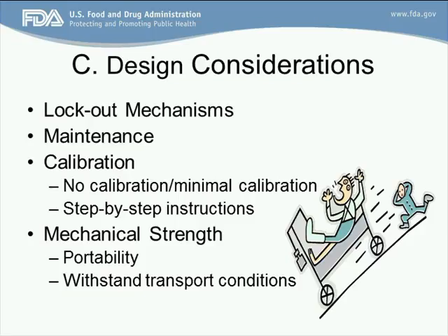And then finally, looking at mechanical strength and how portable that particular device is. Do you want it to be portable? Is somebody going to make it portable if it shouldn't be portable? And how can it withstand transport conditions? Can somebody be bumping into things? Can it fall? The fall test is really very important here because we tend to drop a lot of things. And how can this withstand good transport conditions?